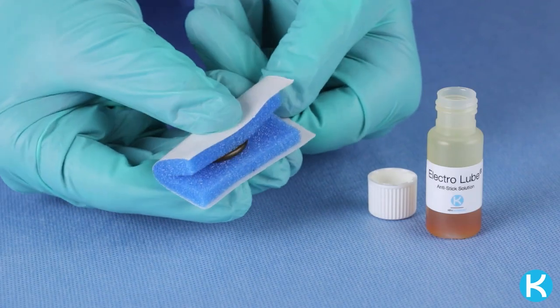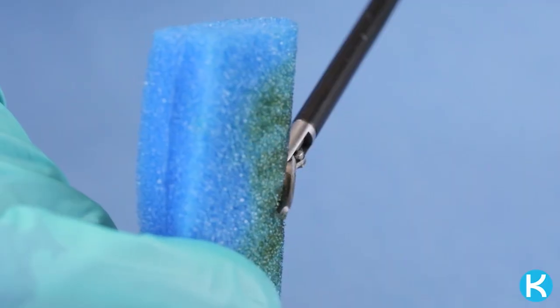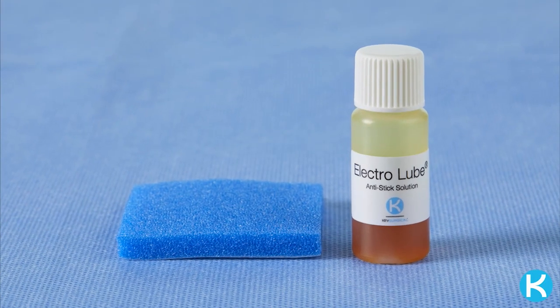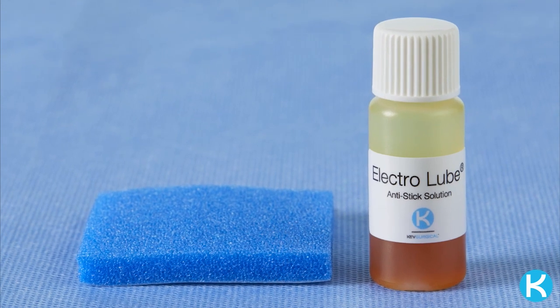To coat a jointed instrument, fold the pad, allowing the Electrolube to absorb, then grasp the fold with the instrument. Electrolube can be reapplied as needed. The included foam pad has a radiopaque strip and also features an adhesive backing. For counting and disposing, please follow your facility policy.